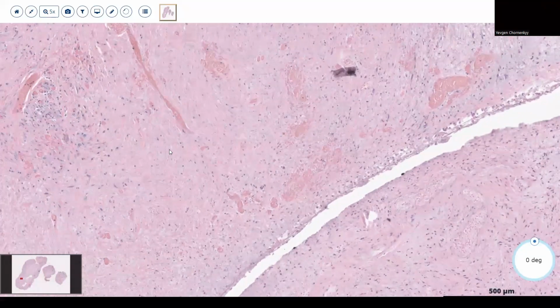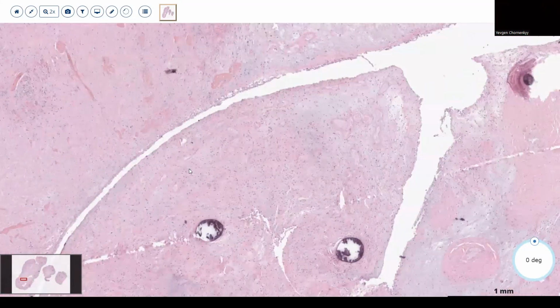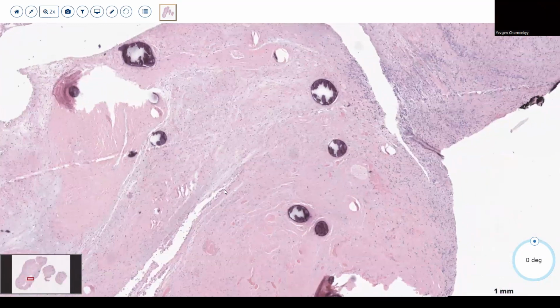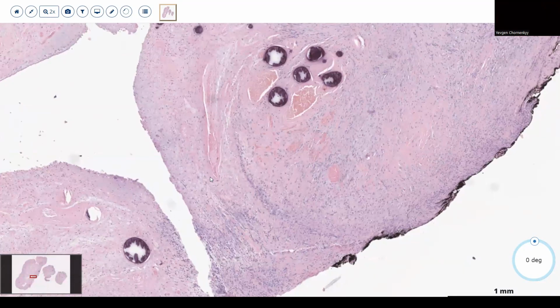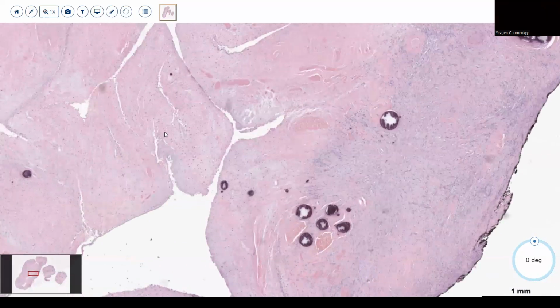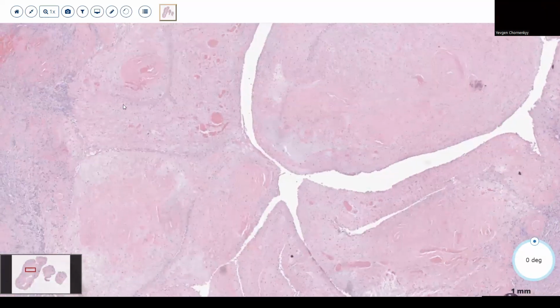Come on, you guys have seen soft tissue pathology. Look at this really dense collagen, lots of calcs. Is this screaming rhabdomyosarcoma at you? No. What about leiomyosarcoma? No, it's not. What about SFT? Maybe. What about a desmoid? Those long sweeping fascicles, right? And not here so far. It's fibrosing, it's calcifying. That sure sounds like one of the answer choices, right?